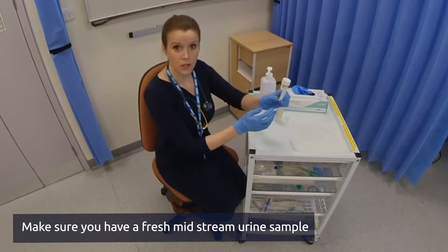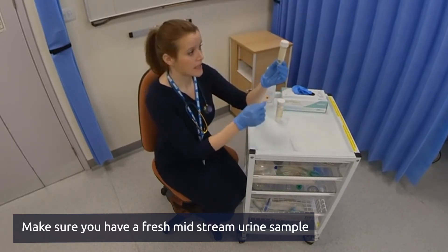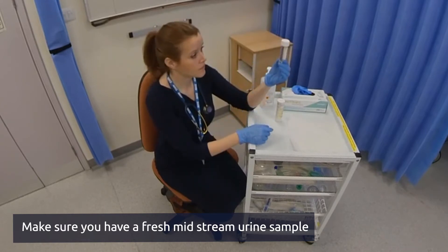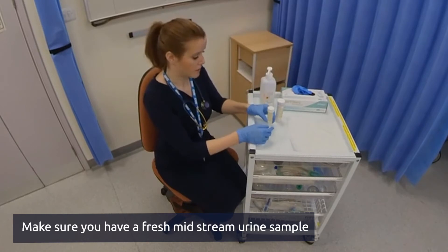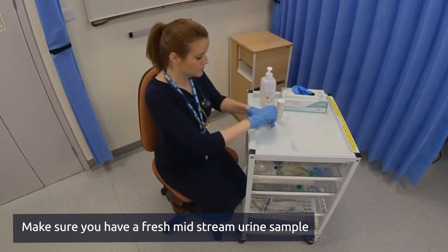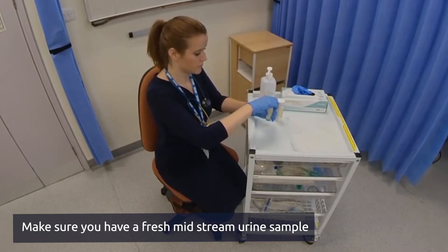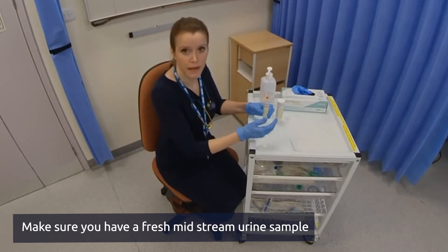The first thing you want to do is look at the colour of the urine itself and see if it's cloudy at all and check for any sediment. Next you want to open the bottle, and at this point it's worth noting if there's any odour or smell.